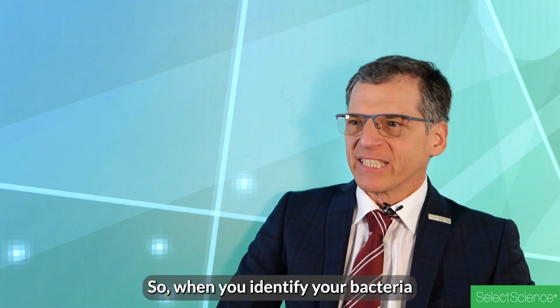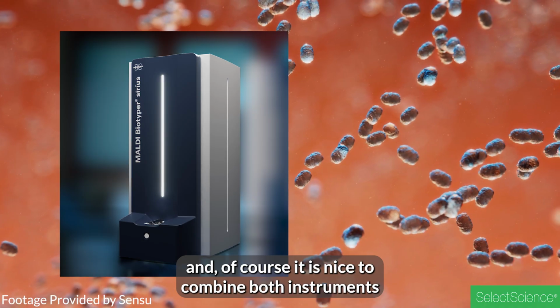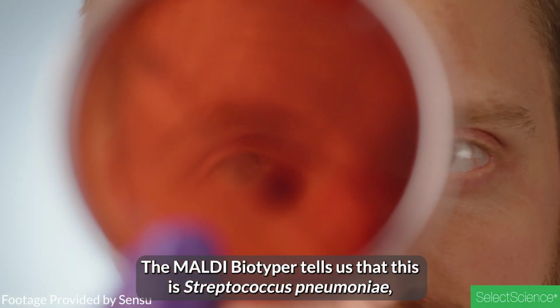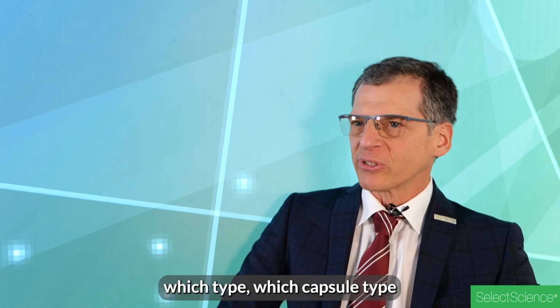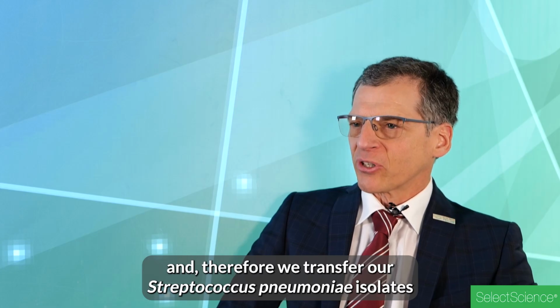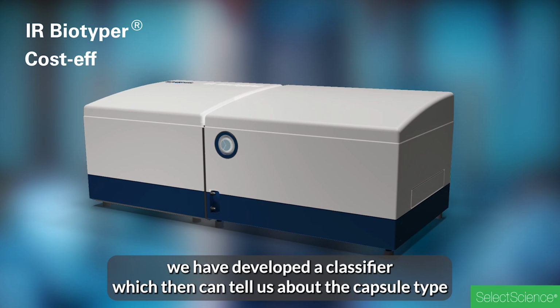So when you identify your bacteria, you already have used the MALDI Biotyper. And of course, it is nice to combine both instruments. For pneumococcus, which is one of the main causes for sepsis, the MALDI Biotyper tells us that this is Streptococcus pneumoniae. But then often for the clinicians, it's important which capsule type of pneumococcus that is. And therefore we transfer our Streptococcus pneumoniae isolates from the MALDI Biotyper to the IR Biotyper. And together with Bruker, we have developed a classifier which then can tell us about the capsule type.